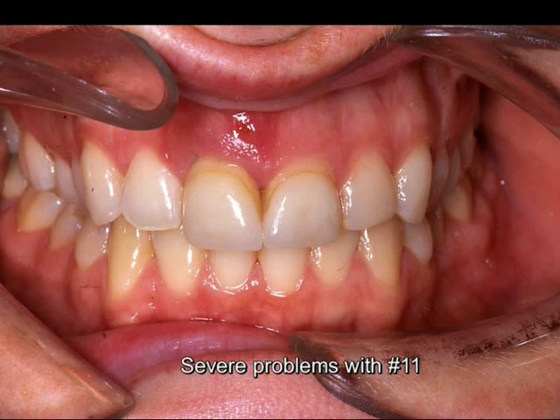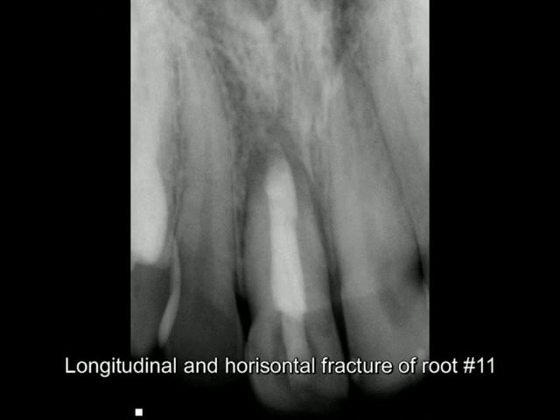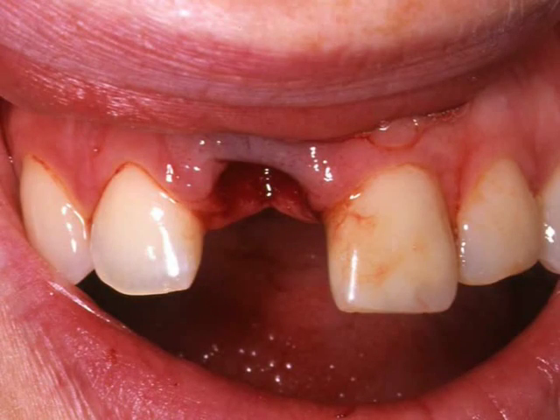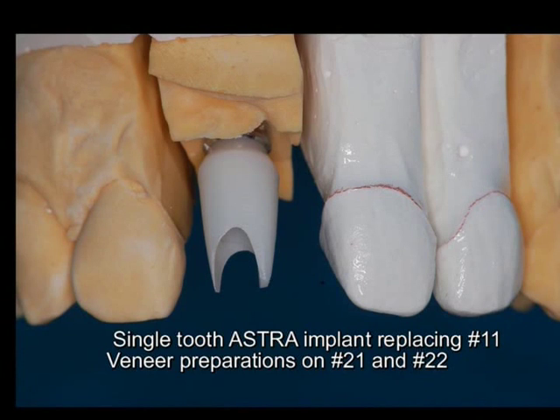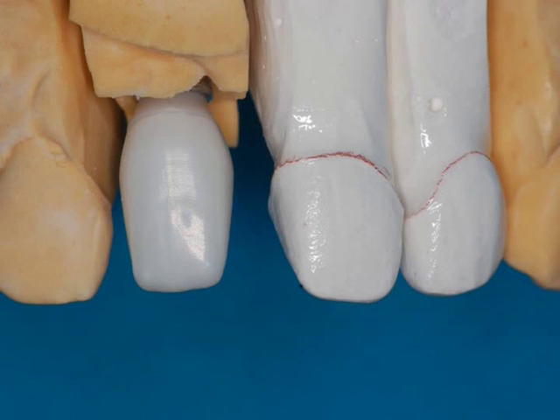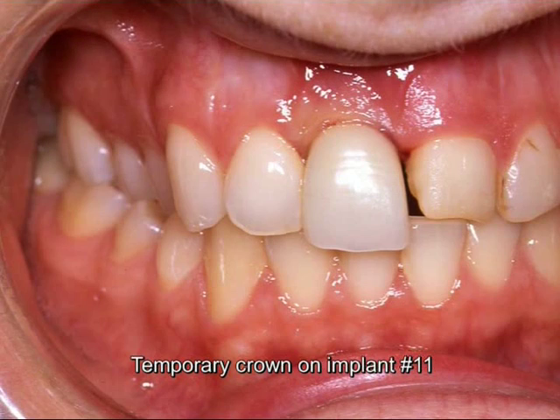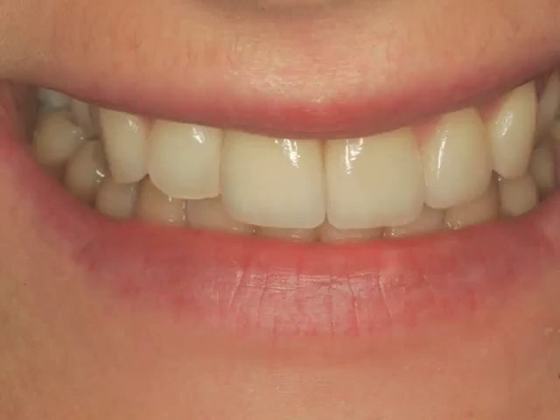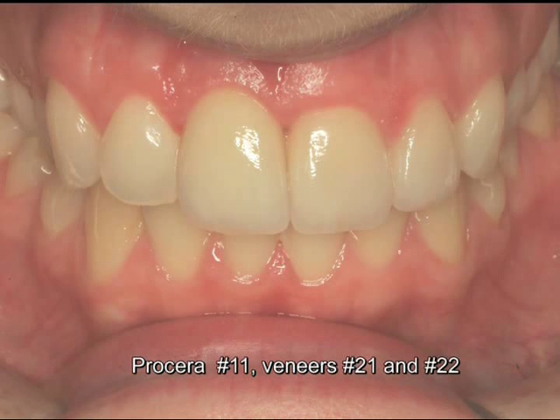Severe problems on this 28-year-old girl. The upper right central was fractured and had to be extracted. She did have some composite on the other central and one lateral. So we had a single tooth Astra implant here replacing the lost tooth. This is a temporary crown on the implant where we are sculpting the soft tissue. And this is a finished case with the lateral and central, both veneers, and the upper right central single tooth implant.